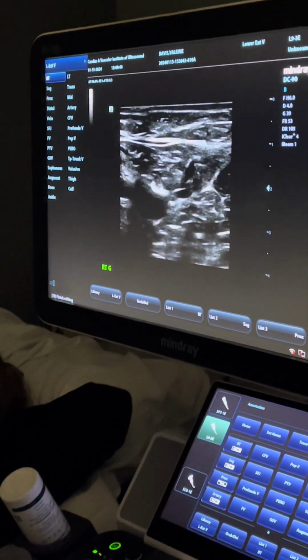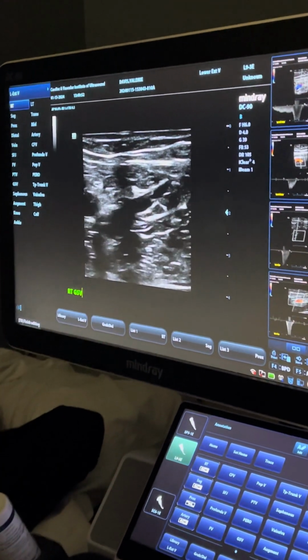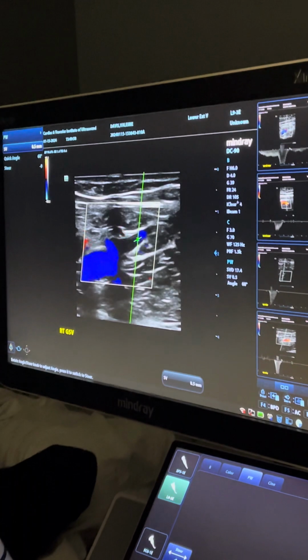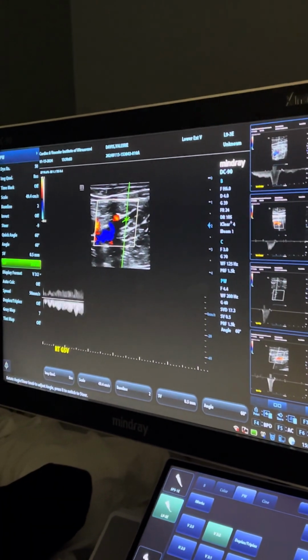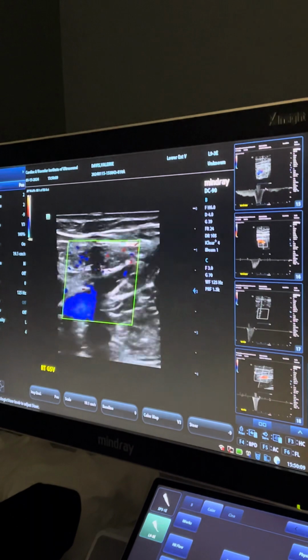This is the only time we're gonna Valsalva. So I'm gonna find this in transverse, drop my tail a little bit. We can see our valve right here. I'm gonna put it here because I see color flow here. All right, Olivia, I'm gonna get you to take a breath in for me. I want you to bear down and breathe. I'm gonna do that one more time.